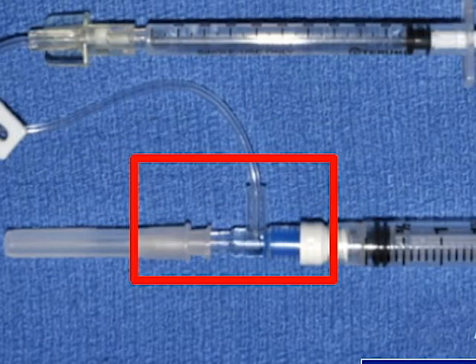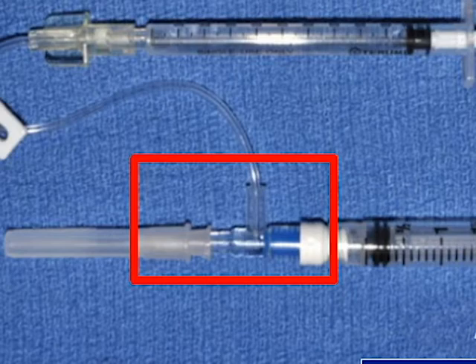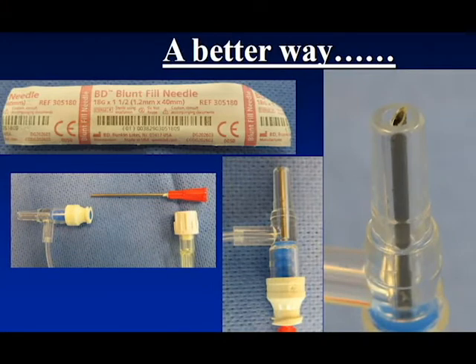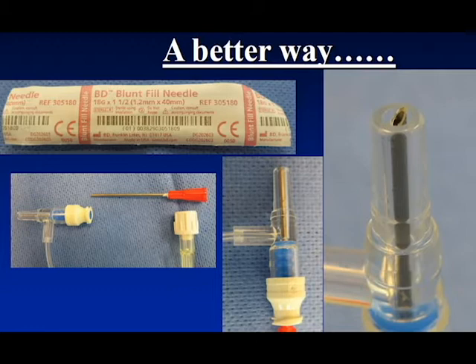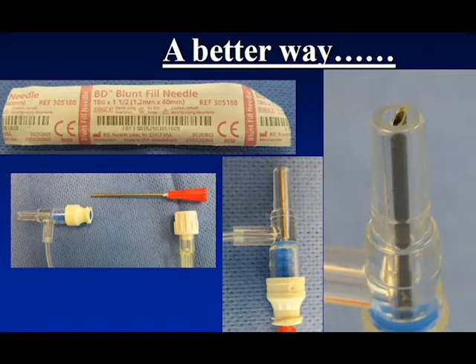Because of the small volumes in many of these cysts, it's possible that the dead space is so large that you're really not exchanging cyst fluid for alcohol as much as one would like. To deal with this issue, I've used a blunt fill needle to fill the majority of the space within the connector so that dead space is minimized. With this setup, I generally attach the alcohol syringe to the hub of the connector and aspirate through the sidearm.